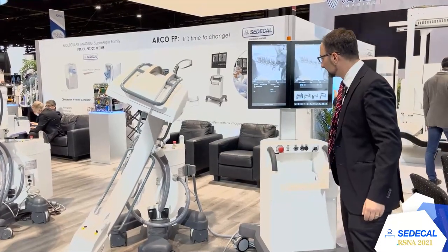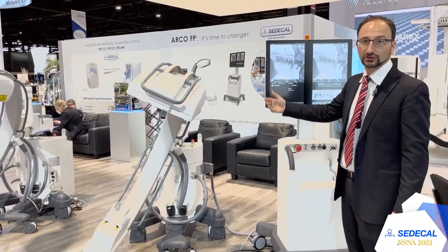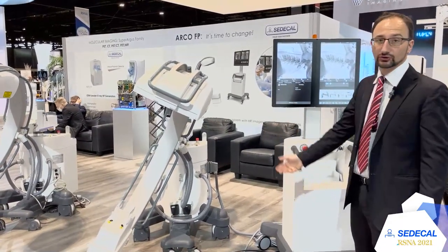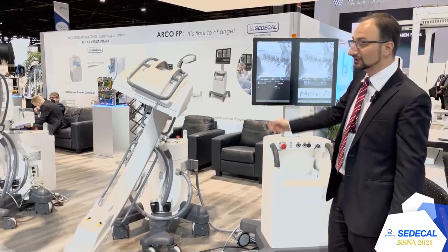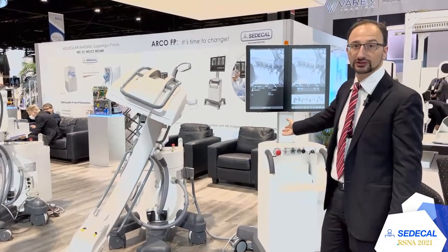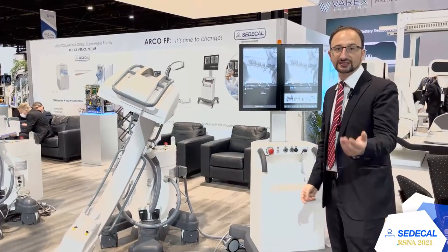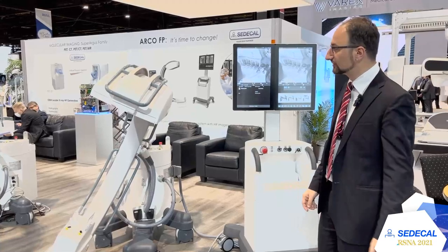This is its trolley. When you plug the trolley, the system automatically switches on and you can start to work. If you don't connect the cable, it's still possible to switch on the trolley and see the previous images, send to PACS, and check previous examinations.